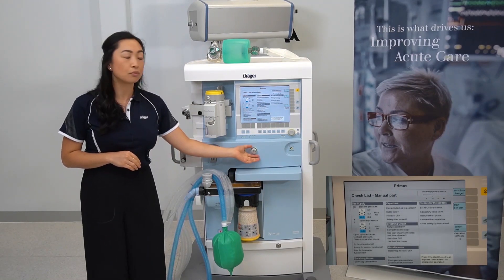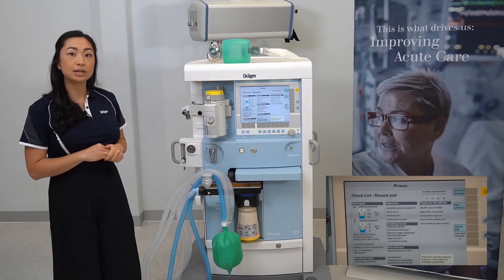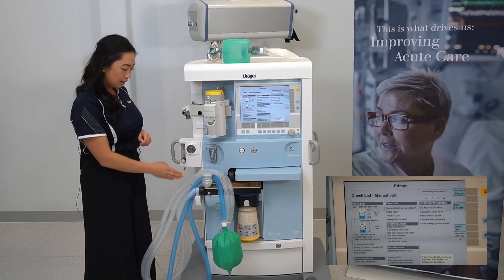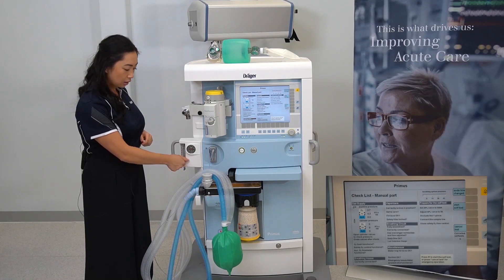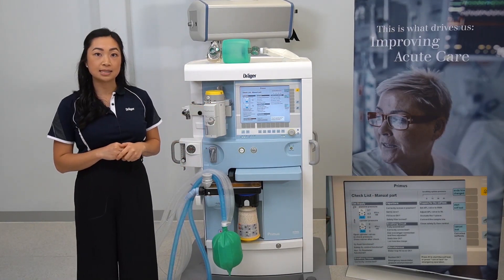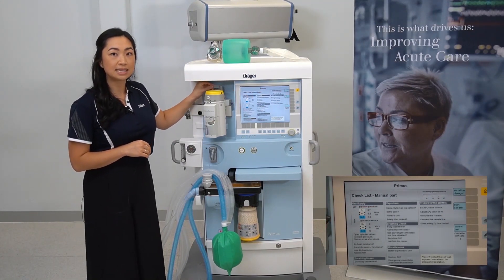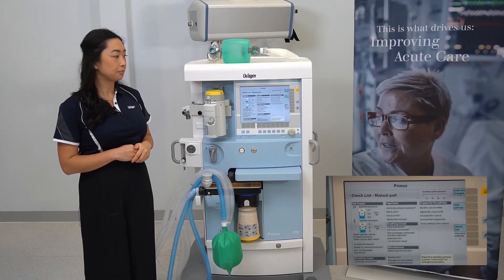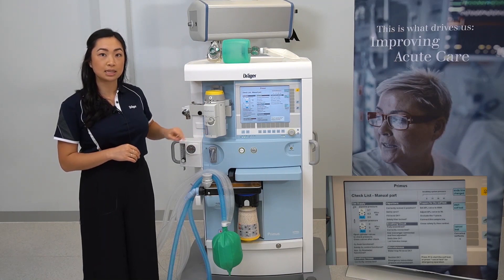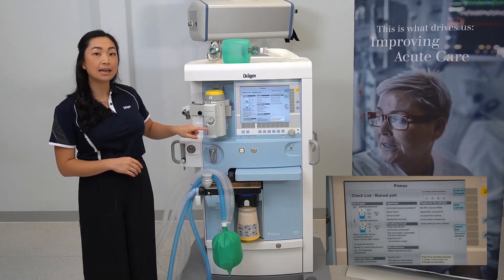To verify your auxiliary oxygen flow meter is functional, open the flow meter and feel for gas, then close it again. To ensure your vaporizers are ready for the system test, push the lever back to indicate it's in a locked position, set the dial to zero, check the fill level through the sight glass, and check that the safety cap filler is properly threaded and closed.